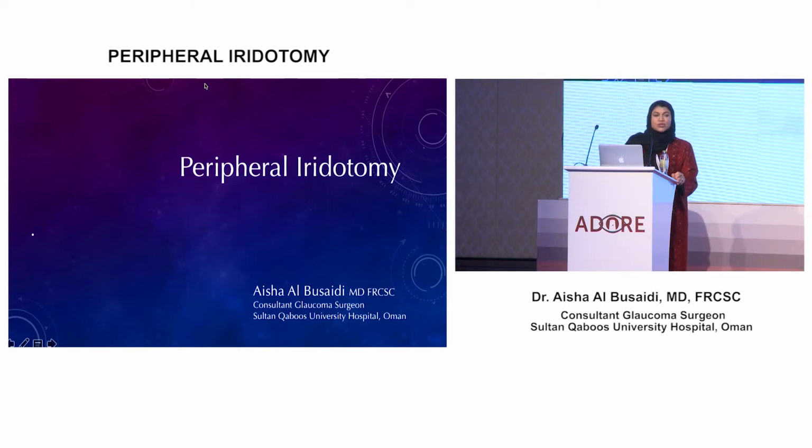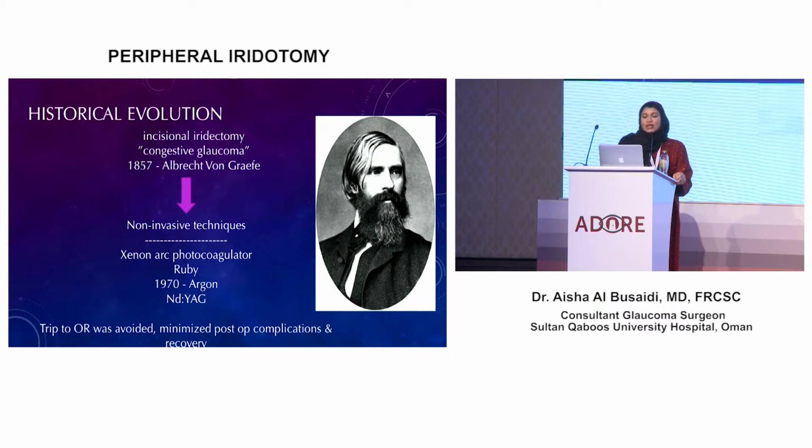So we'll move on to another basic topic, peripheral iridotomy. After von Graefe introduced peripheral iridectomy, or incisional iridectomy, to treat congestive glaucoma, that drew the interest of many ophthalmologists to look at non-invasive techniques to do the same thing, which is creating a hole in the peripheral iris. So they used many lasers to do that.